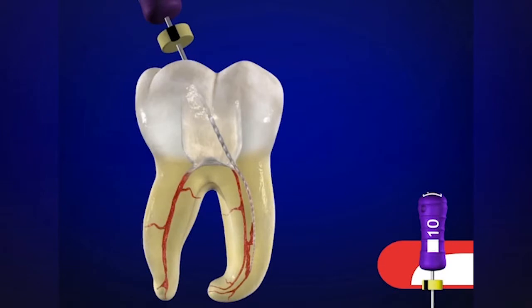Let's look at some of the concepts we've just talked about. When we slide an instrument into a pulp chamber that is filled with a viscous chelator — such as ProLube, Glide, or RC Prep — the instrument will slide into the orifice and oftentimes down into the body of the canal many millimeters, oftentimes to mid-root, or in some instances, to the junction of the middle and the apical one-third.